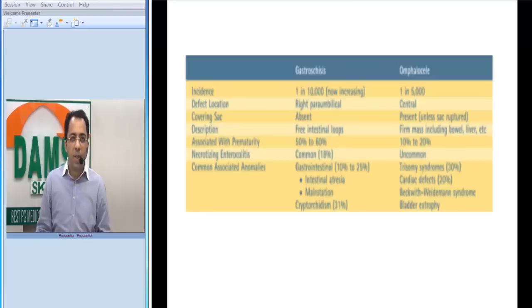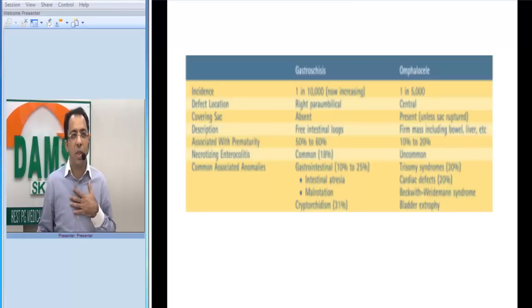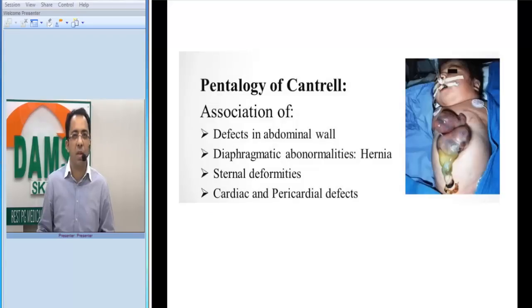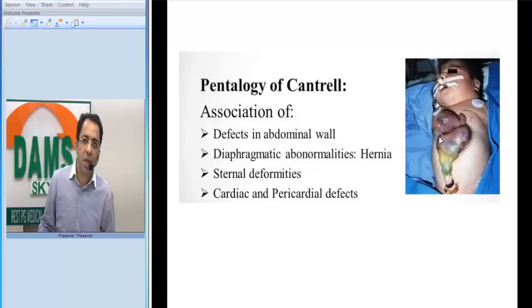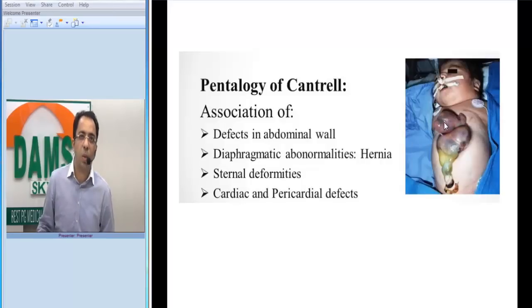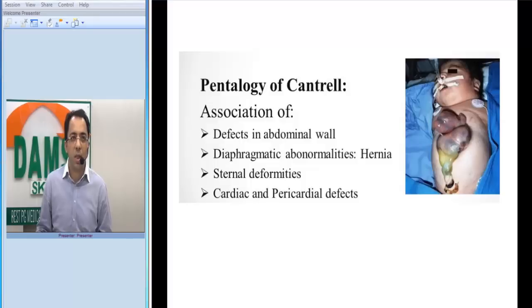Now imagine a patient with omphalocele in which even the chest wall is defective. You can see a central abdominal wall defect and the cardiac chambers are outside — there is a sternal defect with ectopia cordis. This association of omphalocele with cardiac defects, sternal abnormalities, and ectopia cordis is called the pentalogy of Cantrell.